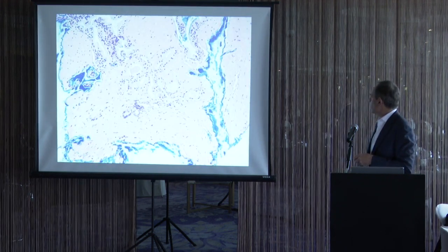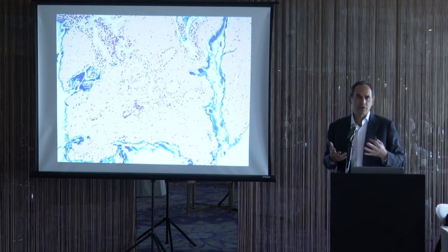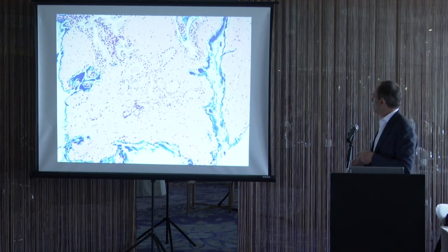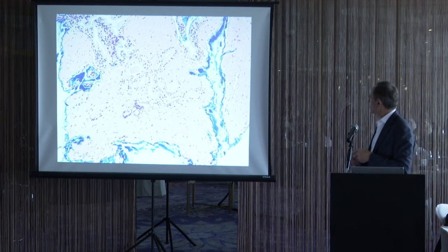Here's another case of partial atrophy. So again, partial atrophy will stand out. It'll look different than the surrounding glands. Different doesn't equal cancer in prostate pathology. You want to look at it if it looks different and assess it, but ultimately, some of the benign mimickers can look like cancer at low power.